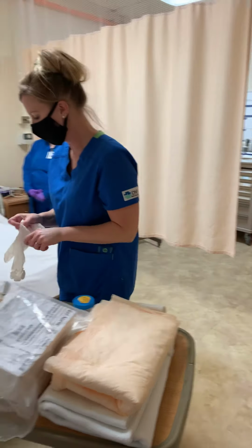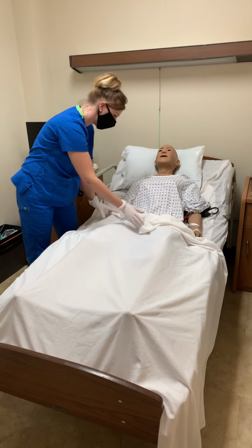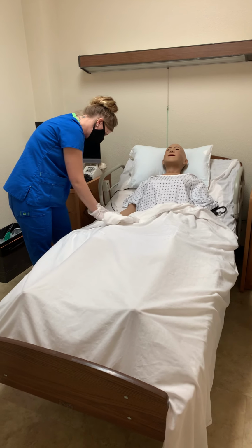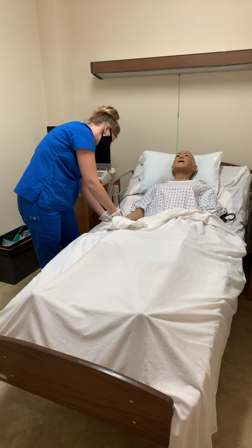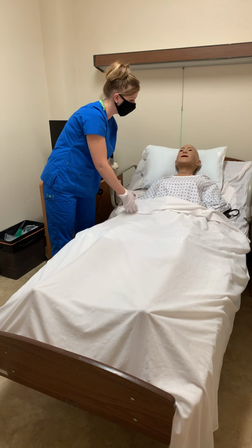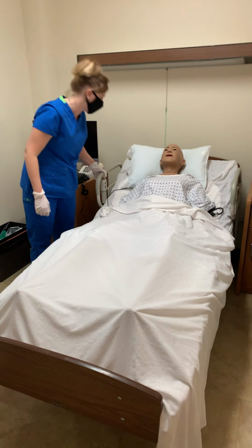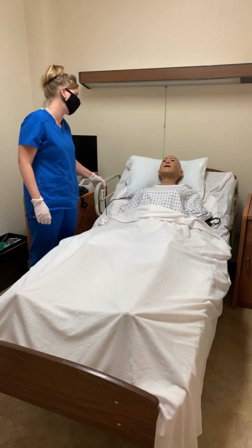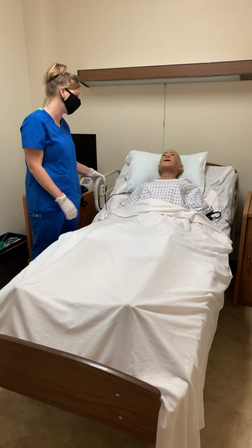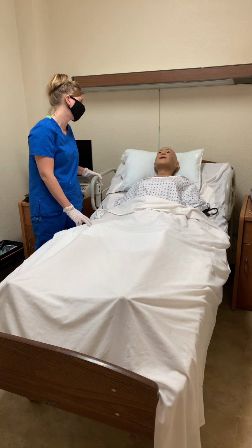Okay, I'm just going to check your armband here. Joanne Jones, 12/3/1967. And Joanne, are you allergic to anything other than penicillin, such as silicone or iodine? No, ma'am. Just penicillin. Okay. And Joanne, on a scale from 0 to 10, 0 being no pain at all, and 10 being the worst pain that you've ever felt, can you tell me your pain? Oh, 0 pain, Miss Sheena.